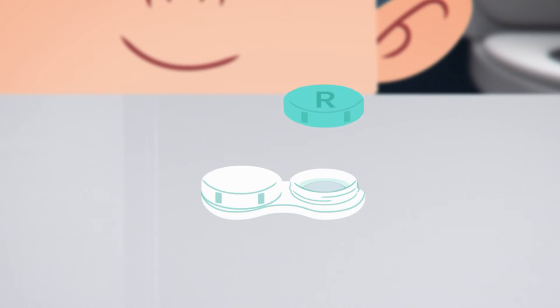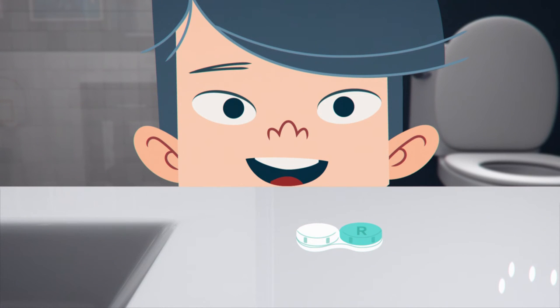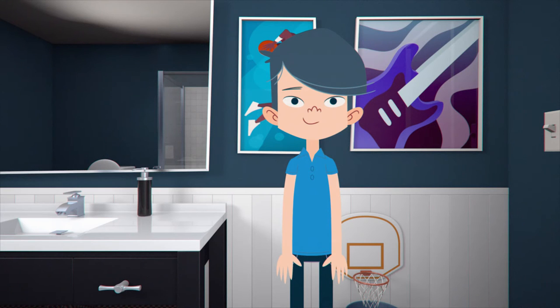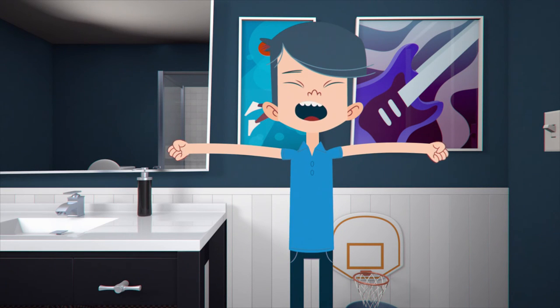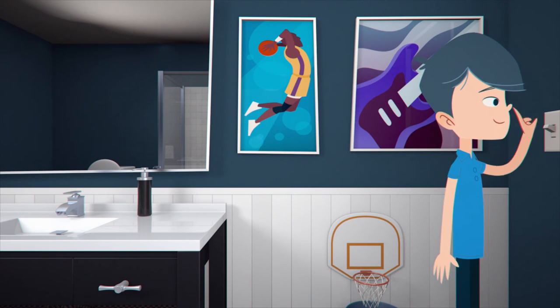The caps should indicate whether they're for the right or left lens. Nice work James! Now repeat the process for your other lens. It takes about 6 hours for the solution to clean your contacts, so letting them sit overnight is perfect. Good job James, and good night.